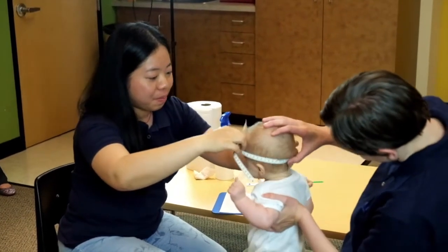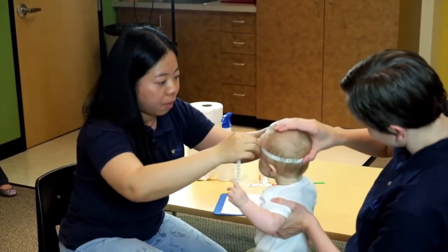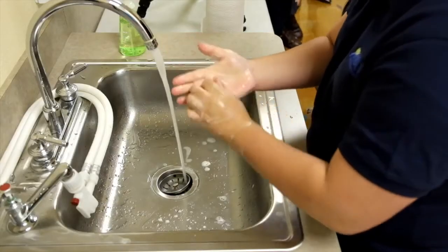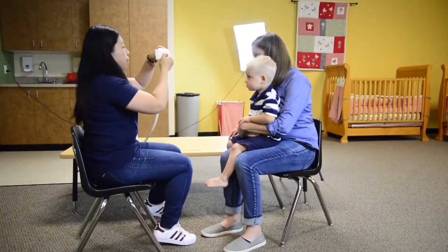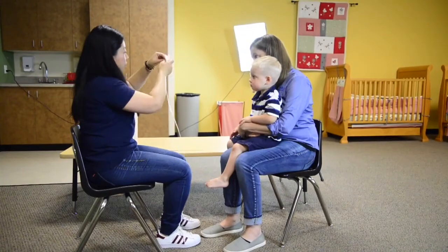It is very important to take this measurement quickly and accurately while using the appropriate tools. The person measuring the child must first wash their hands. Ensure the head circumference tape is sanitized to avoid the spread of illness.